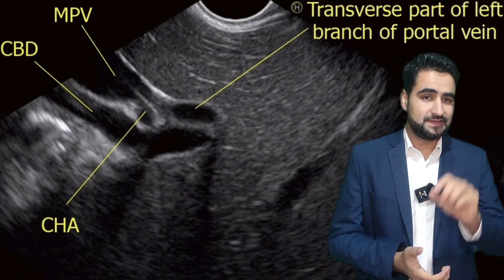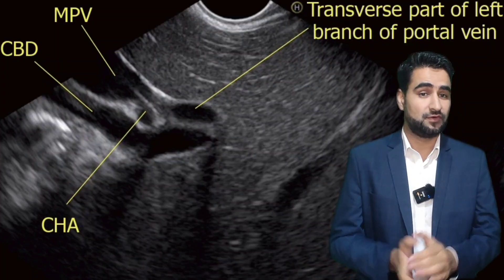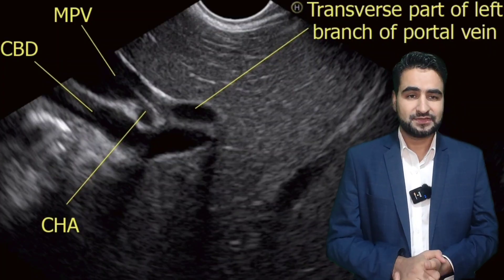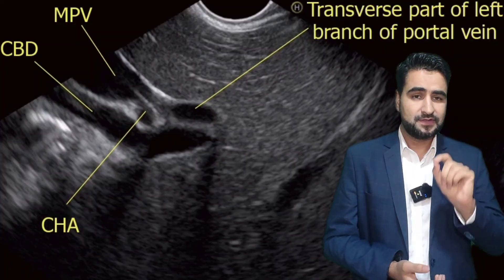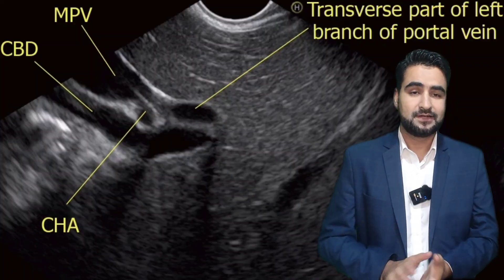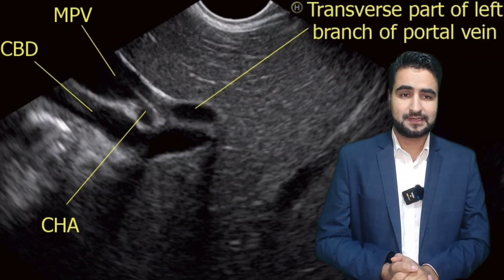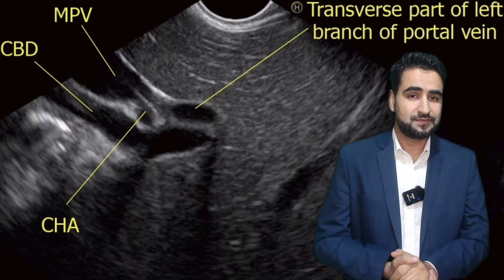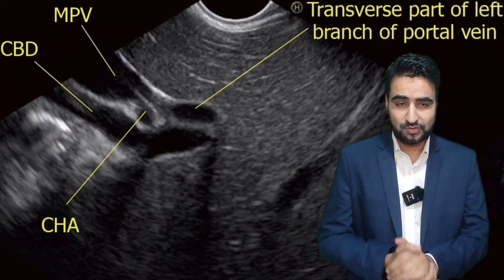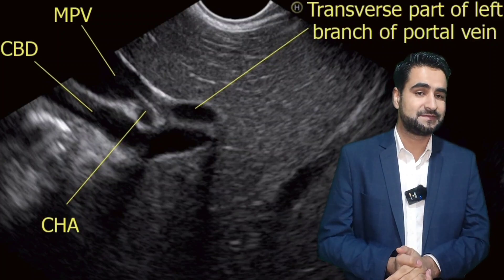In this first image, with a slight clockwise rotation from the neutral position, we start following the left branch of the portal vein as it courses through the transverse fissure of the liver. A few key landmarks to note here: the common hepatic artery appears anteriorly, the common bile duct is seen running parallel, and most importantly, the transverse part of the left portal vein is visualized clearly. This step confirms that you are aligned with the portal vein plane and ready to trace its main branches.